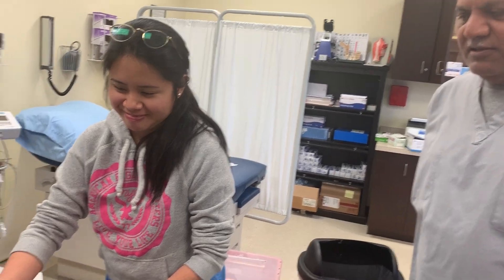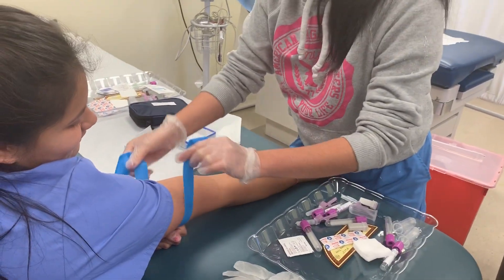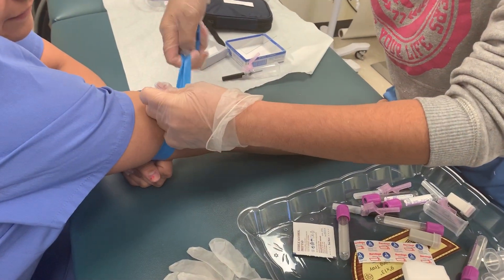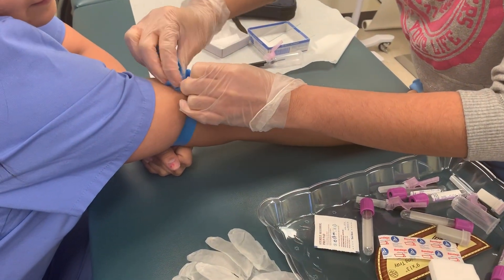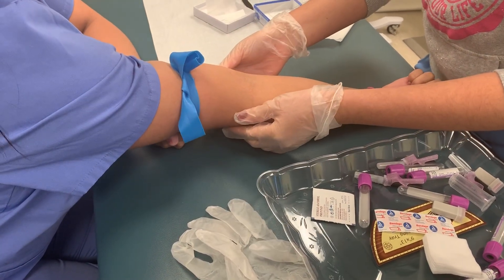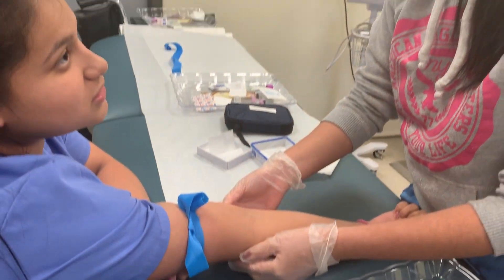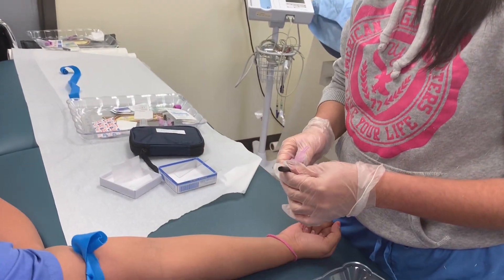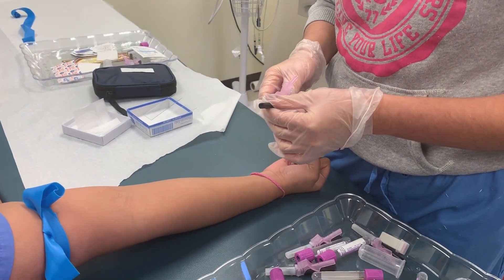She is tying the tourniquet to pop up the vein. You clean it, right? Yeah, I cleaned it already. Okay, see — already cleaned with the alcohol pad, and now she's ready to collect the blood.